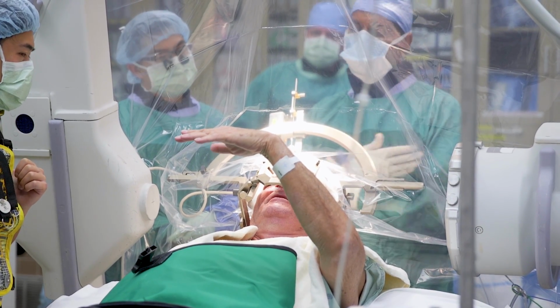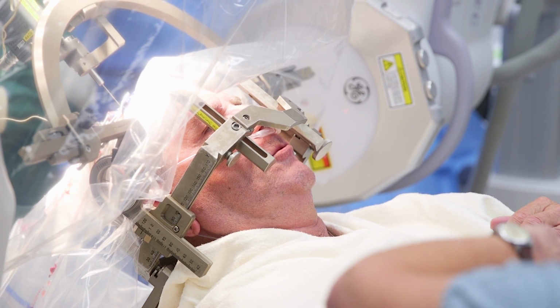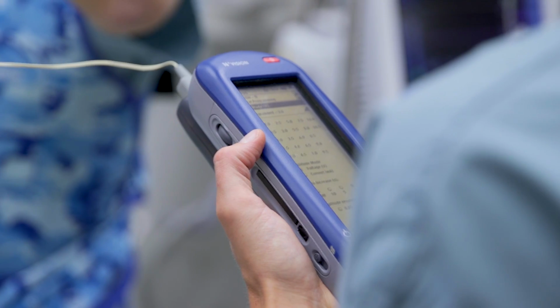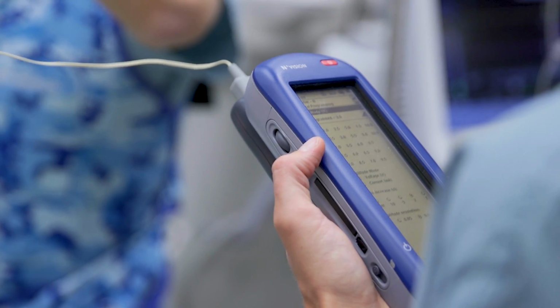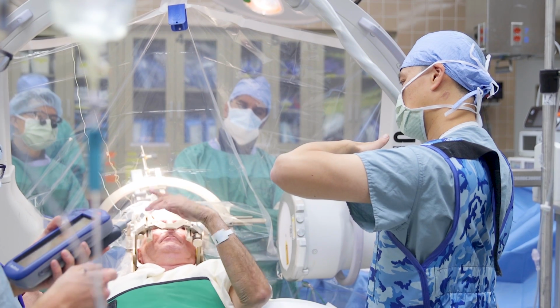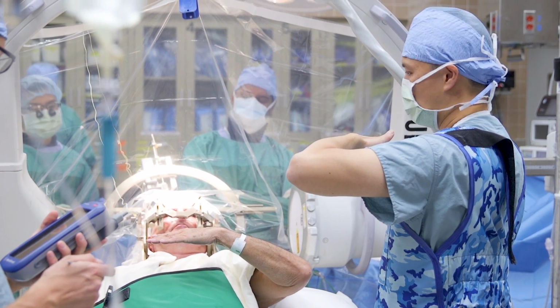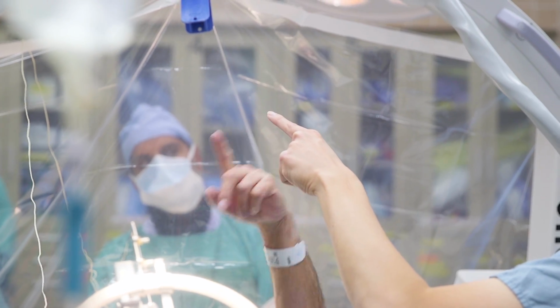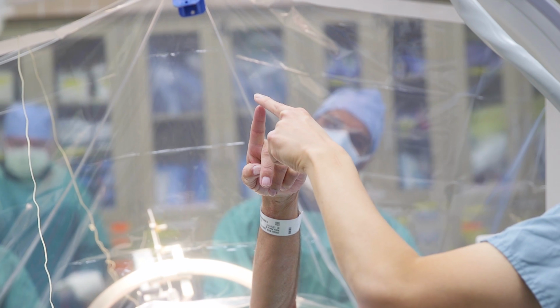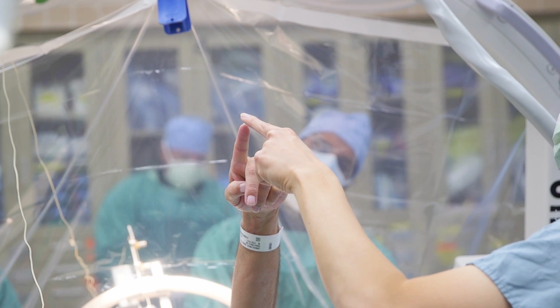At the University of Michigan, most often deep brain stimulation is done awake. The reason for this is that it's absolutely critical that we know that we're in exactly the right spot. Even in the same disease, different patients' brains are different. By having the patient awake in the operating room, there's an opportunity for Dr. Chu and Karen Cluin, our speech pathologist, to rigorously test the patient and make sure for that patient the lead is in exactly the right spot.